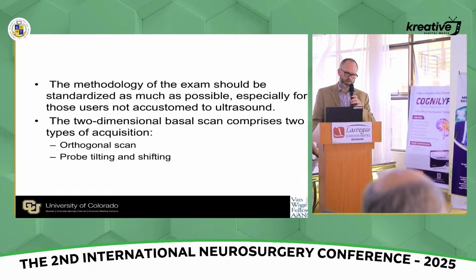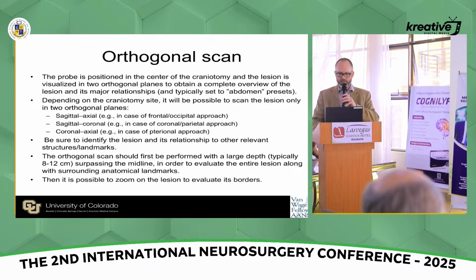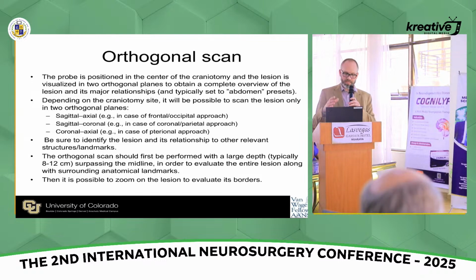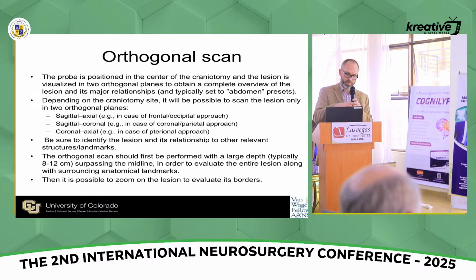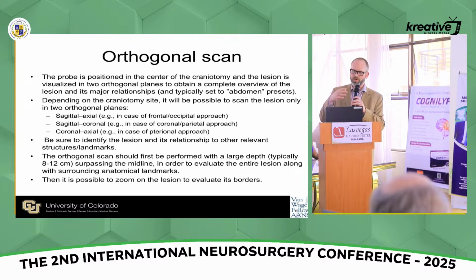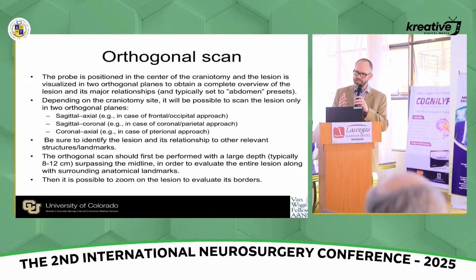I start with B mode, and then in all those 3 modes, and then I go to Doppler to look at the vasculature, and I do it the same way every time, right? And then you want to scan. I usually scan before dural opening, especially with navigation, to help ensure that your exposure is adequate. Then you open dura and look again, because you'll get attenuation through the dura. That's nice to be right on the surface of the brain with the probe to see the tumor better.